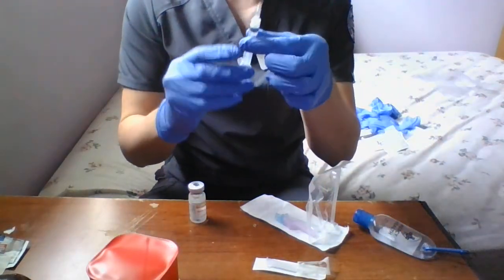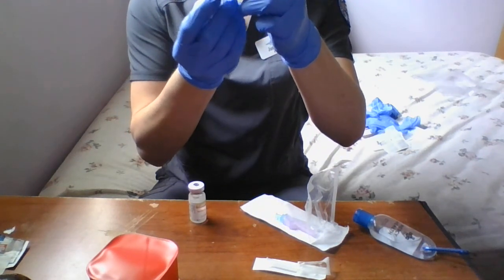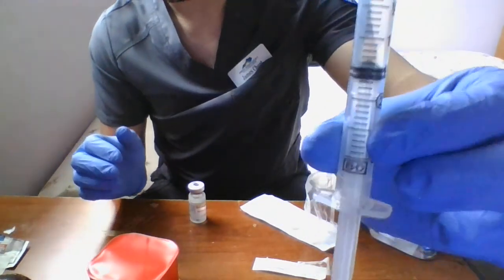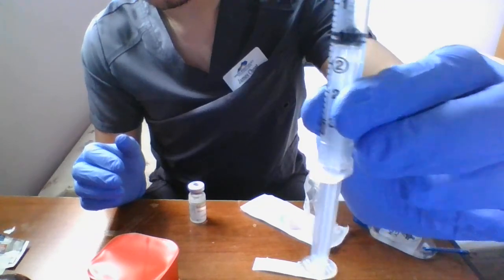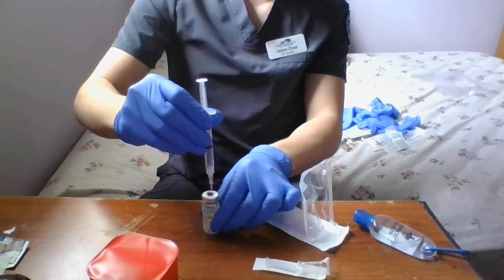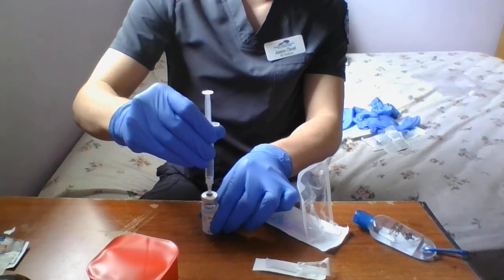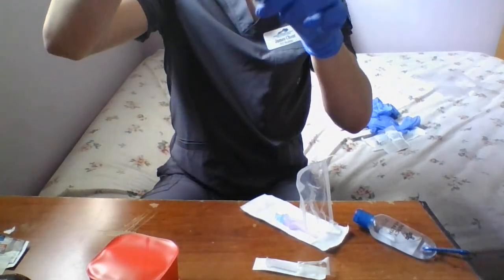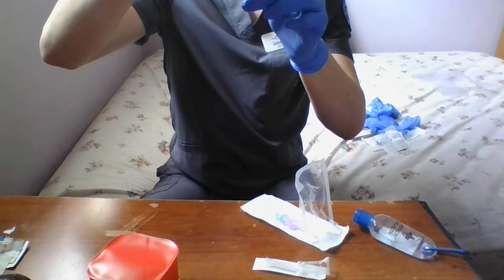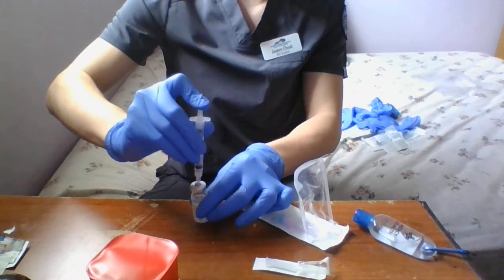All right, using the blunt tip, we're going to be giving 1.5 ml today. So I'm going to draw it up to 1.5 ml of air. One and a half. I'm going to inject this into the rubber seal. I injected the air into it.